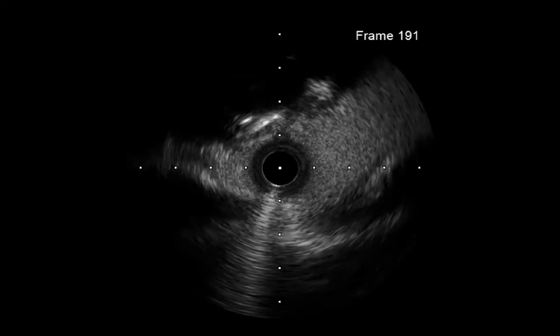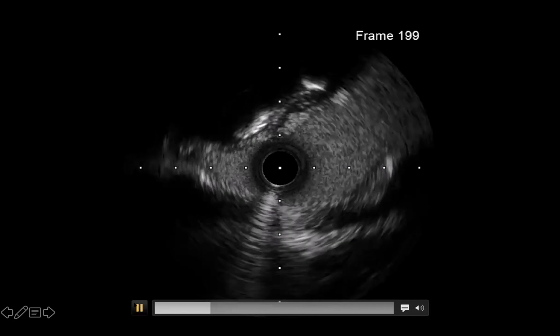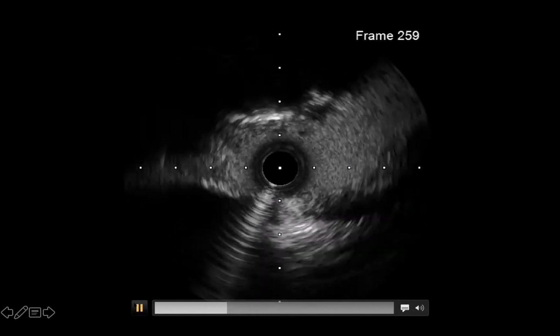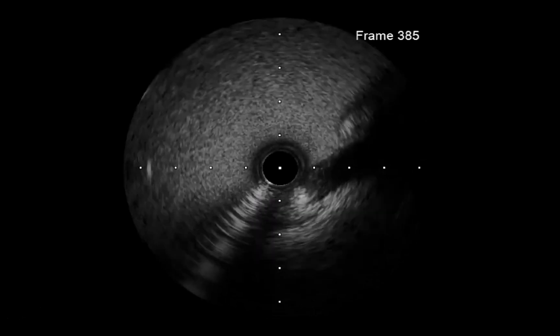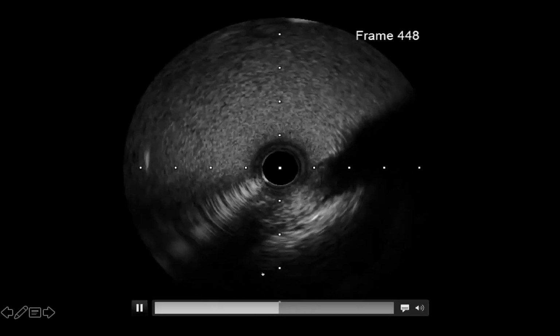But at the same time, when we did the minimal luminal area measurements, the MLA at the tightest point was 5.1 millimeters square. We can't see all the circumference where it's the tight, basically. So how did you measure the area?